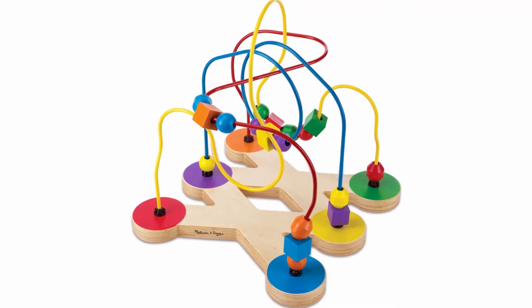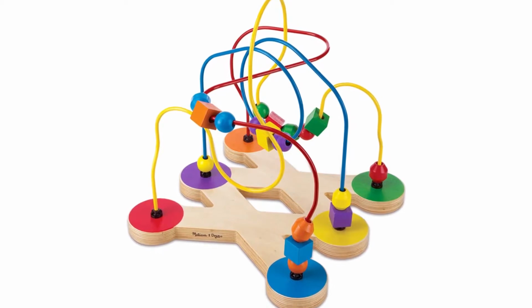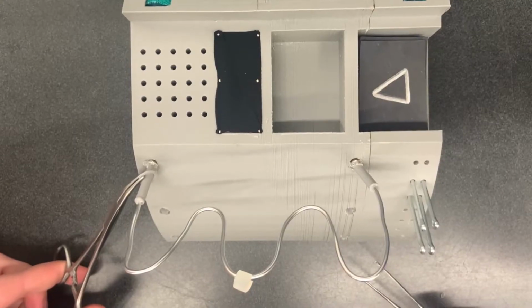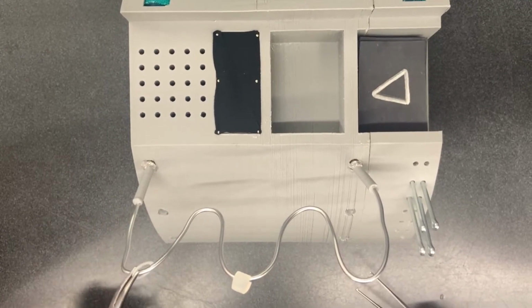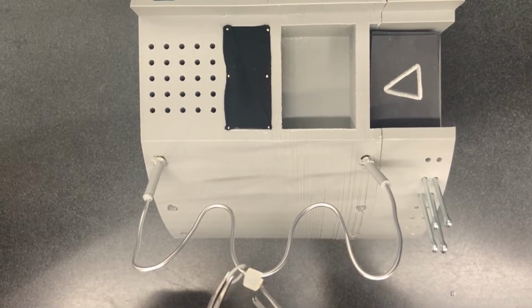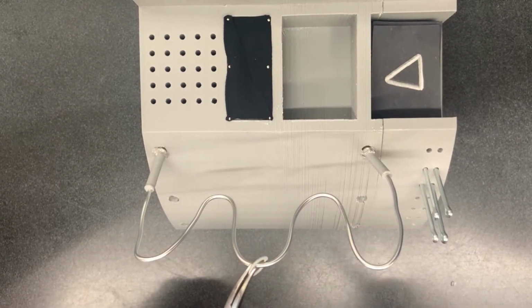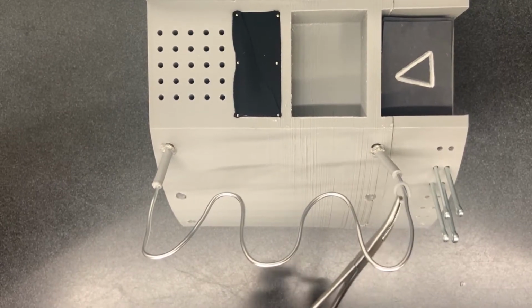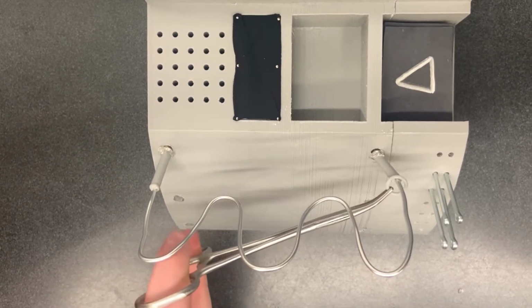The ring track exercise was inspired by the children's developmental toy, the bead maze. Just as with the children's toy, the user maneuvers a bead, or in this case, a rubber O-ring, around a wire track, utilizing fine motor skills. Along the track, the user must move impedances or blockages out of the way using the fourth arm in order to continue moving the ring.